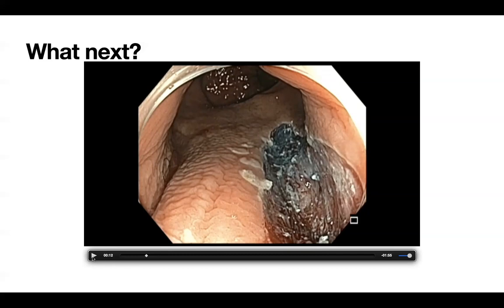The issue here, there are two. One is that you have this exposed hemorrhoidal plexus, and they could be injured even though they're not bleeding yet. If you use an APC, they basically just evaporate. It is a very easy procedure to devascularize the area from this hemorrhoidal plexi.